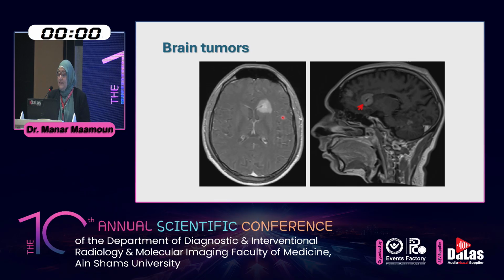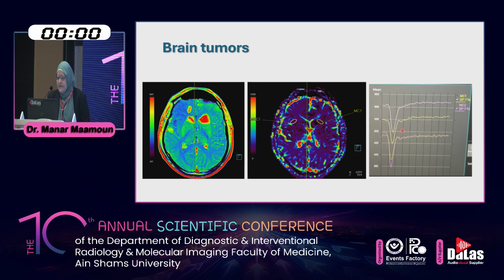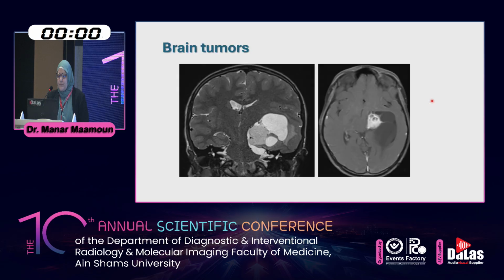Another case with CNS lymphoma showing a characteristic finding on the time intensity curve, with the washout showing elevated percentage signal recovery, which is characteristic for lymphoma cases.